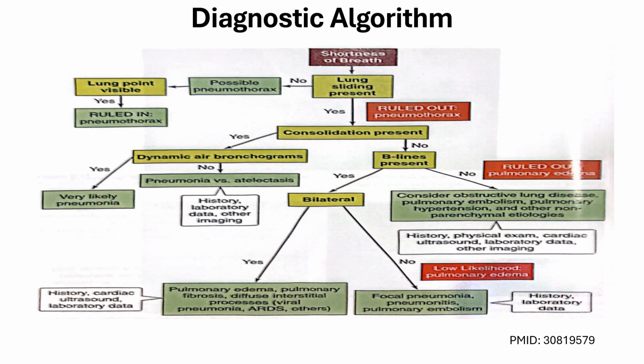Let's take a look at this diagnostic flowchart, which can be used in the workup of respiratory distress with ultrasound. Obviously, know your patient, know the presenting history. There are several questions which can be answered with ultrasound, which may help you find the diagnosis. The first question is: is lung sliding present? When not present and accompanied by a lung point, you'd have a diagnosis of a pneumothorax.